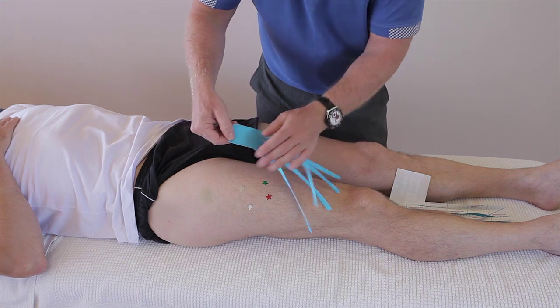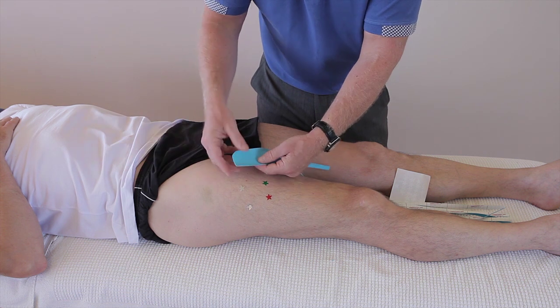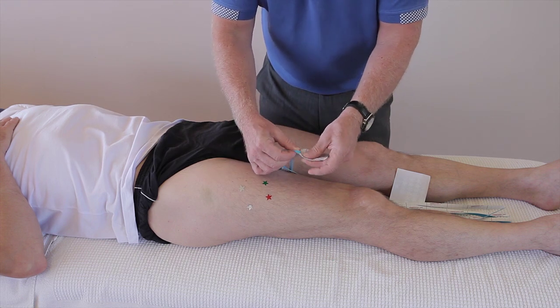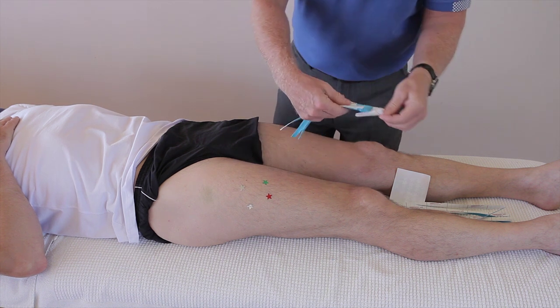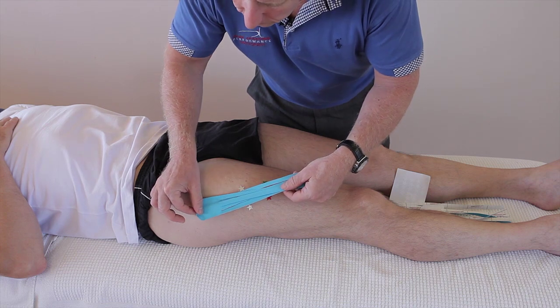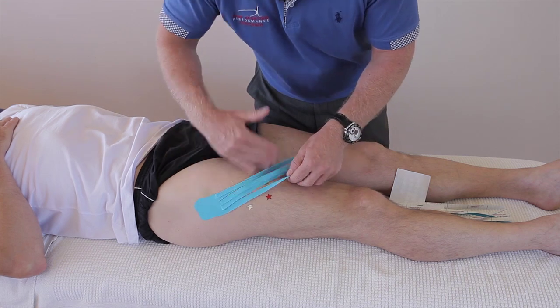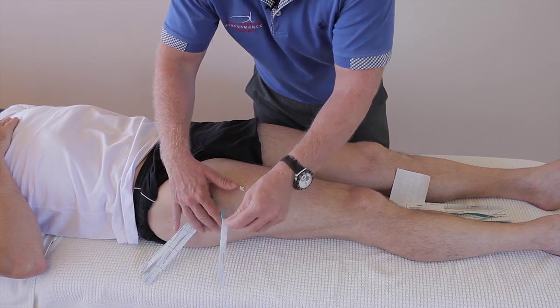When you're looking at the tape, the pad tends to go towards the lymph nodes — in this case you've got the inguinal lymph nodes, so the pad is going to go towards that. Turn the tape over and individually split each of the five fingers. Peel that back and then apply it proximal to where the pain is. So that's the first part — get the four fingers out of the way, otherwise it gets a bit fiddly.